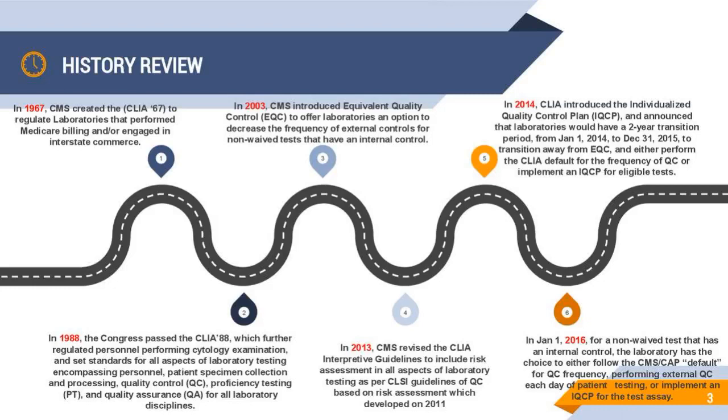And in 2014, CLIA introduced the individualized quality control plan, IQCP. So it started officially in 2014, and it was announced that laboratories would have 2 years for the transition to introduce it in their lab, but it was optional at that time.